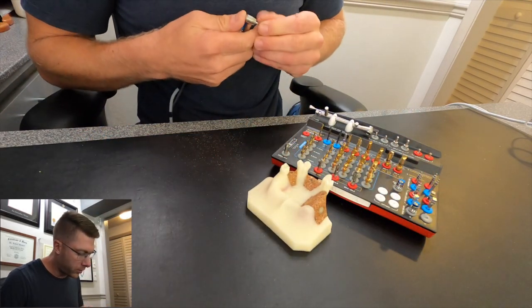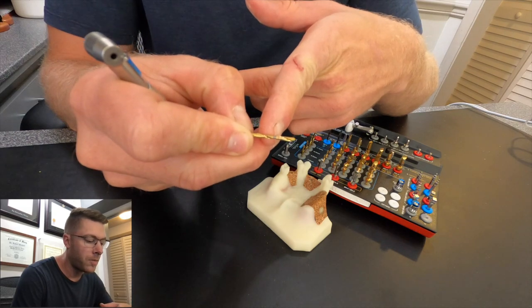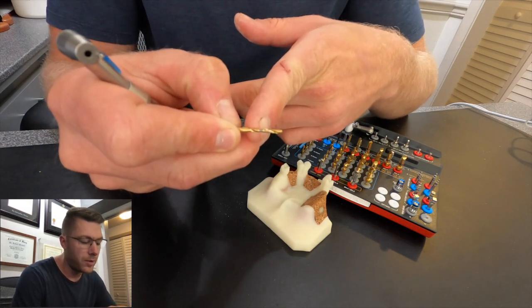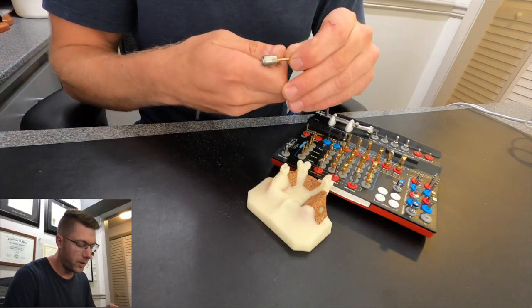There's the first drill done. Now I'm going to go to my 2.0 millimeter. I know that this particular burr has 7, 8.5, 10, 11.5, 13, and 15 millimeter markings, so I always know how deep I am — because technically you're working blind, no different than drilling into a wall, to make sure I'm not going too deep or too shallow. I like to countersink my implants. This particular implant is 10 millimeters long, so I drill my osteotomy to be about 11 to 12 millimeters to sink the implant just below the bone level. I'm going to go to the top of the black mark on this 2.0 drill so that I'm 11.5 millimeters deep for my 10 millimeter implant.